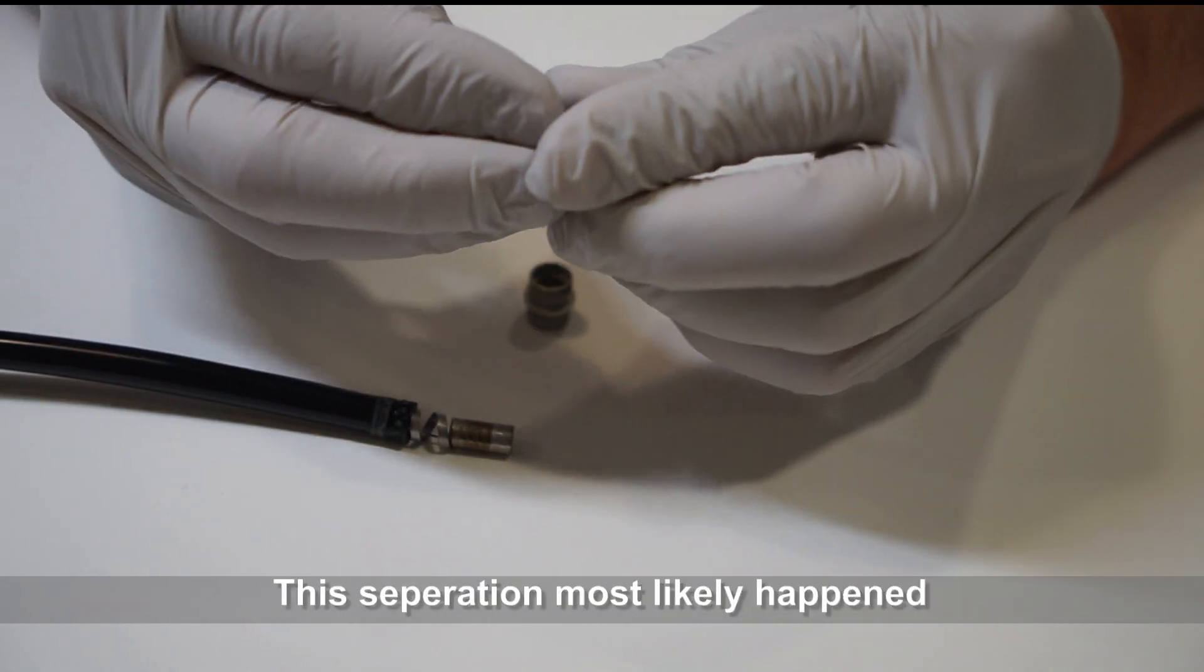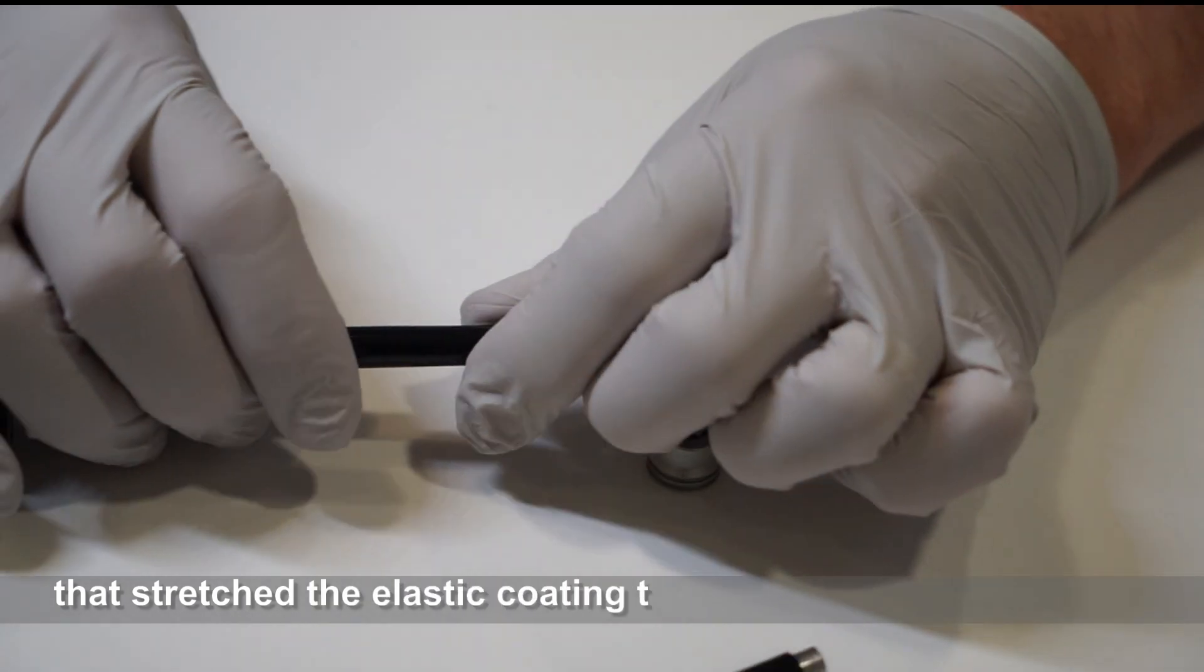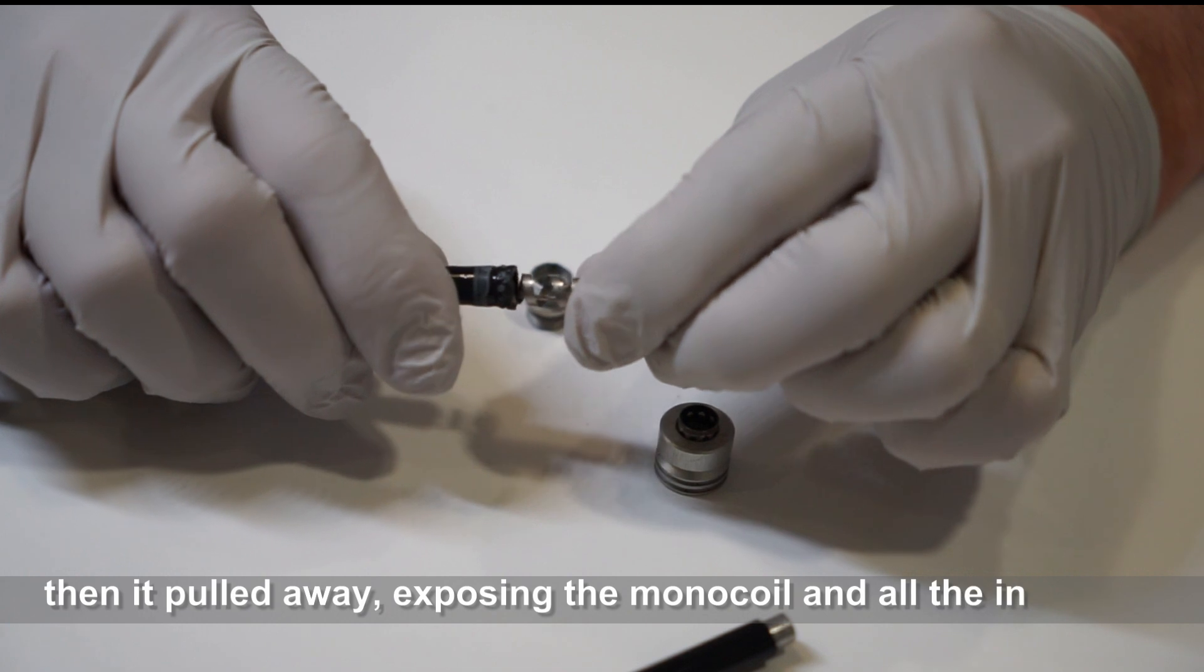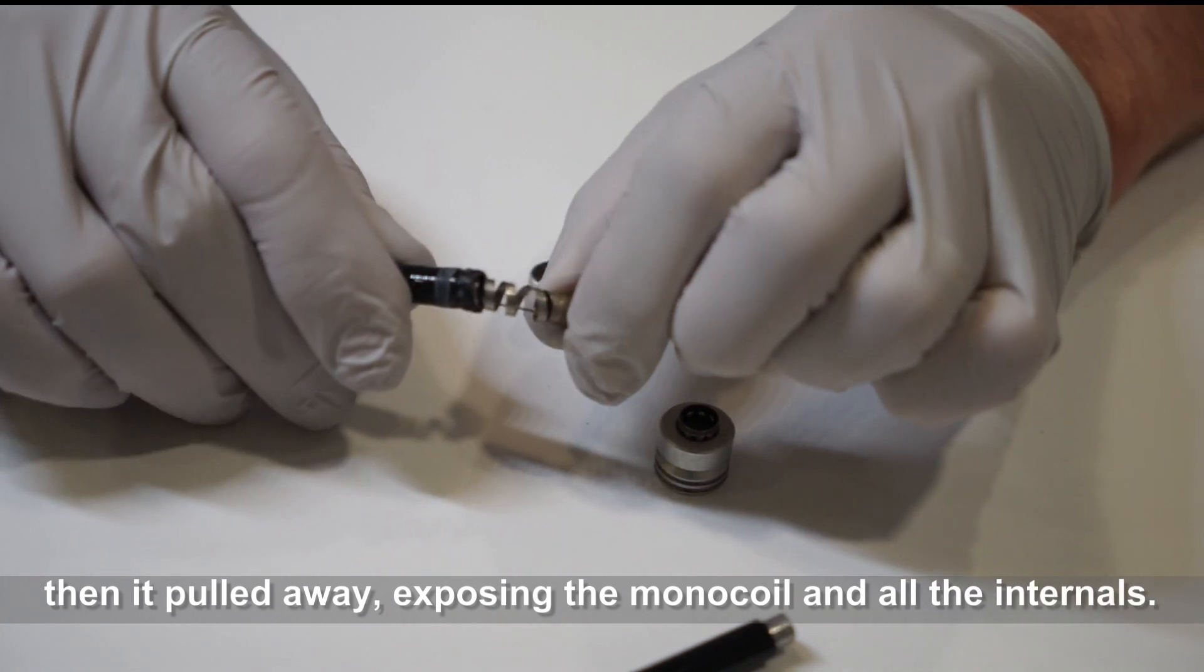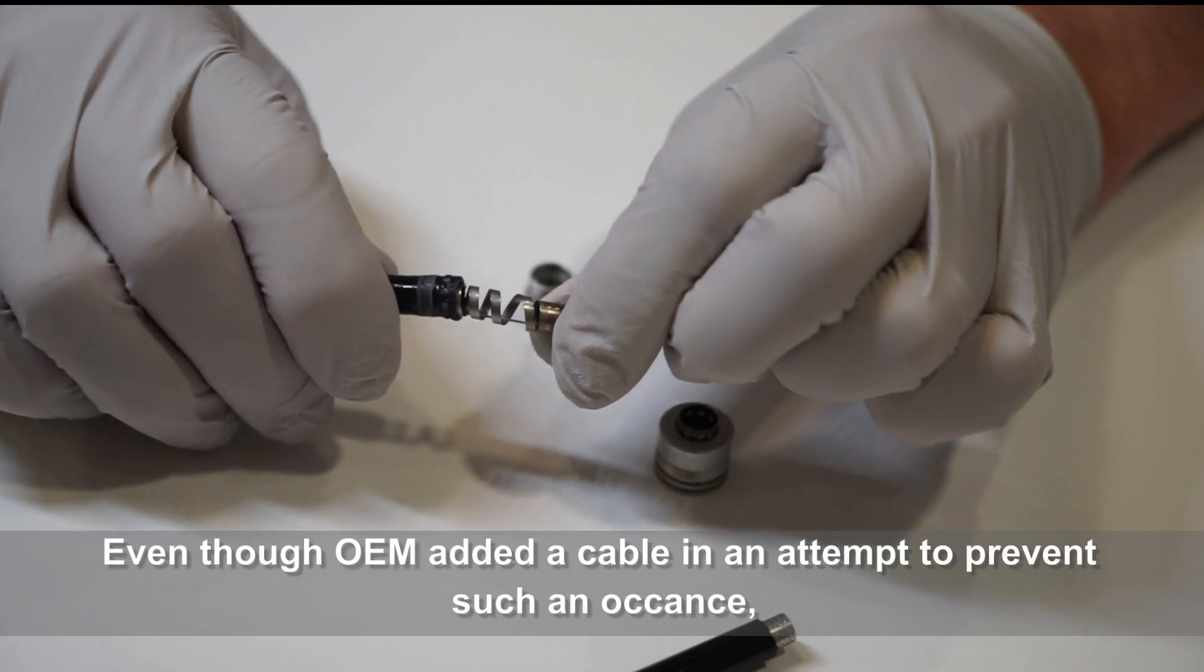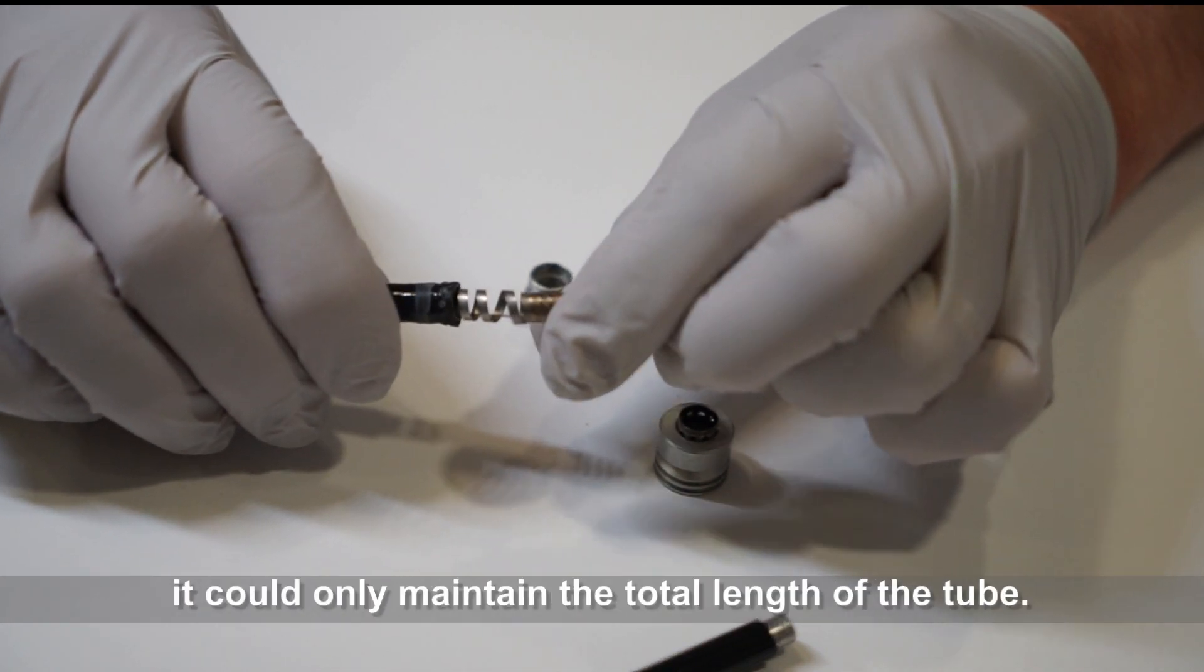The separation most likely happened when the doctor pulled on the cable that stretched the elastic coating thin, breaking the glue bonds. Then it pulled away, exposing the monocoil and all the internals. Even though the OEM added a cable in an attempt to prevent such an occurrence, it could only maintain the total length of the tube.